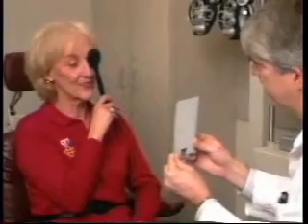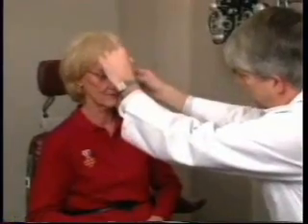The first two points of the eye examination are done with some mechanism for occluding the opposite eye. One method is to use the patient's hand or have her hold an occluder. A second method is to use paper tissue behind the glasses. Fold and place the tissue from the top and remove from the bottom to avoid injury to the ocular surface.